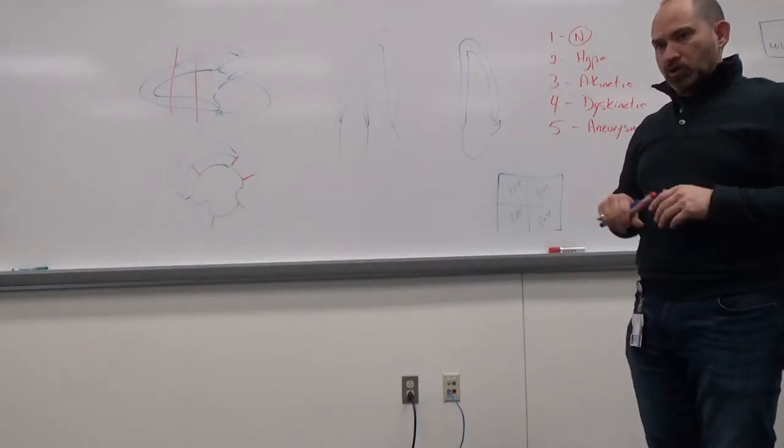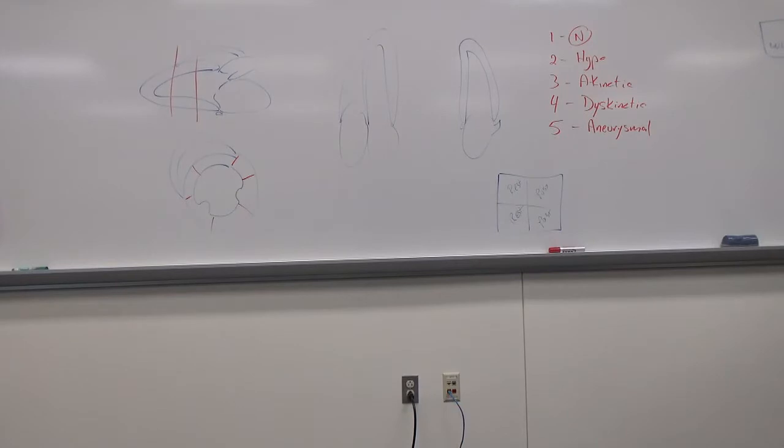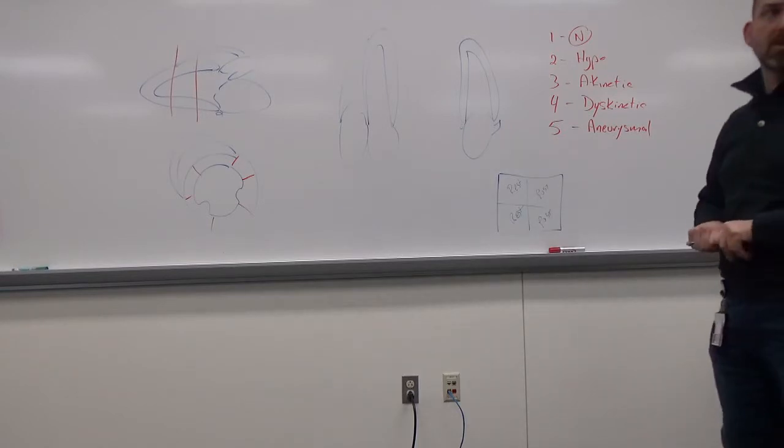All right, so I just wanted you to be familiar with what perfusion is. That could be important. All right. Anything else on stress echo? I think those are all the biggies. So what it is, the types of echo, how to score walls, how to correlate what coronary artery supplies those walls. That's the essence of what we're looking at.